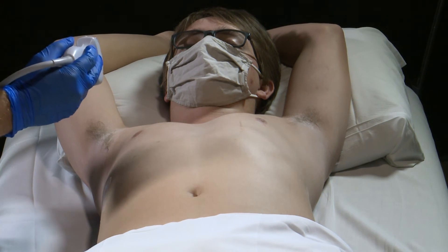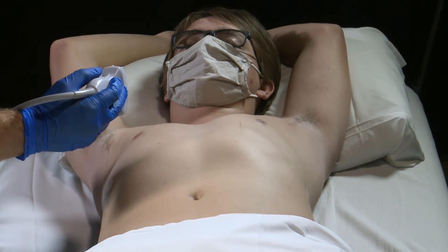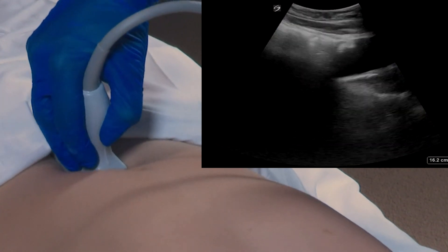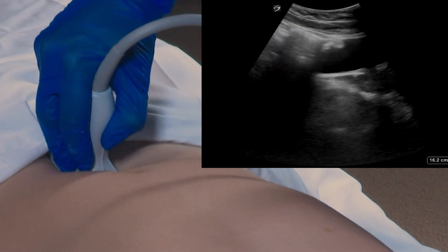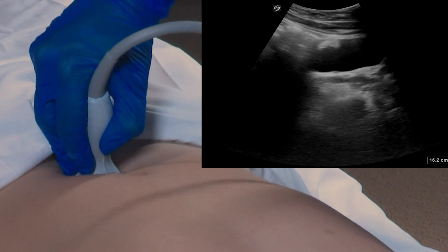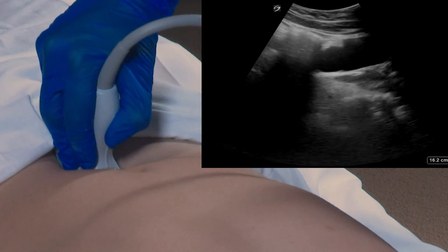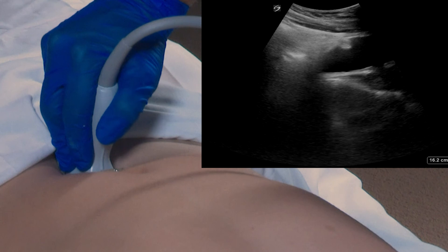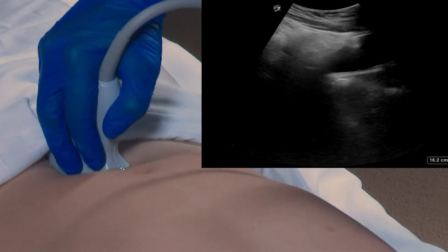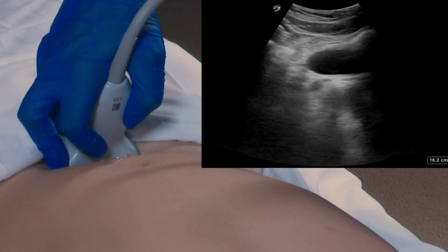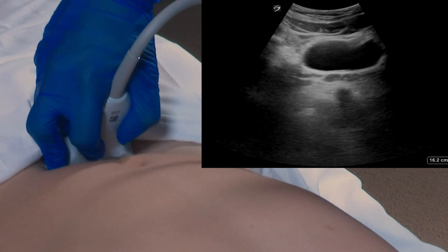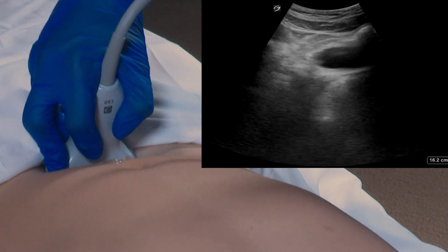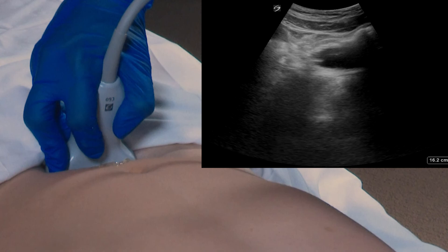For the pelvic views, we're going to place the transducer first in a sagittal orientation with the transducer just above the pubic symphysis. We're going to identify the bladder, and in this case the prostate, and then fan the transducer side to side looking for any free fluid that may be present in this space. After we have looked in the sagittal orientation, we're going to rotate the marker dot towards the patient's right, and again fan forward and backward, making sure to identify any free fluid that may live in the peritoneal space.